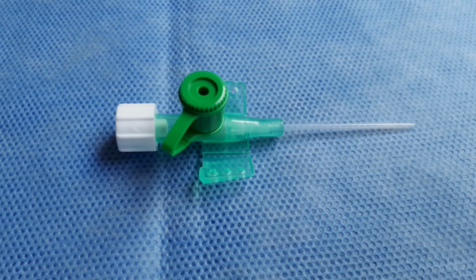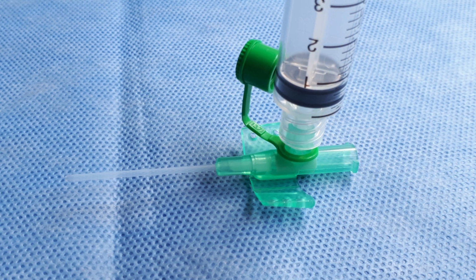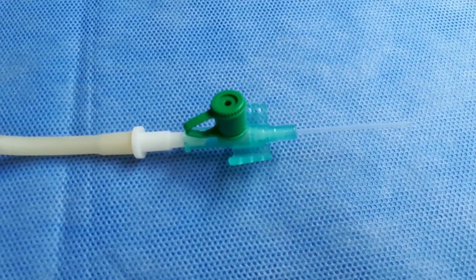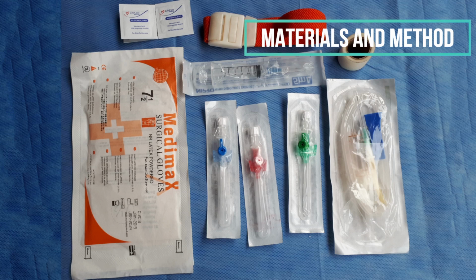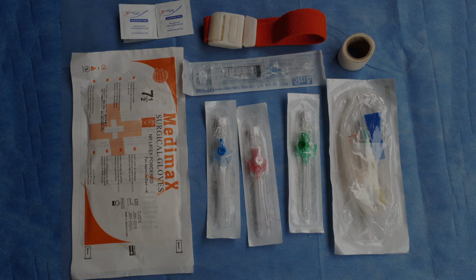This is how an IV cannula looks without the stylet and with the luer lock plug in its place. A syringe is attached to the injection port, and an IV cannula with the injection site of the infusion set is attached with the luer connector. The different materials required for this procedure are alcohol swabs, tourniquet, adhesive tape, a disposable syringe, gloves, IV catheter, infusion set, and gauze.